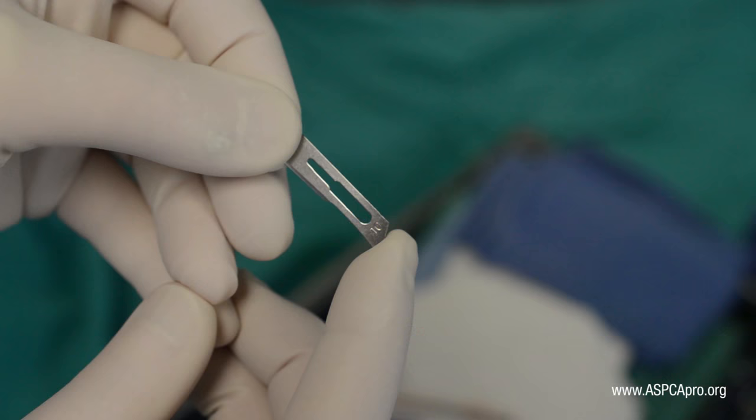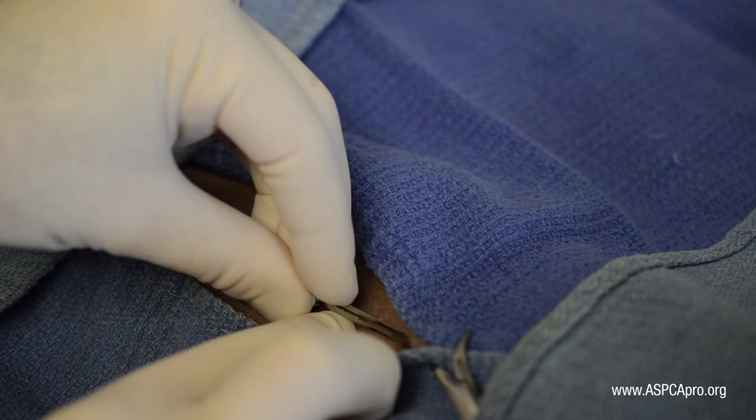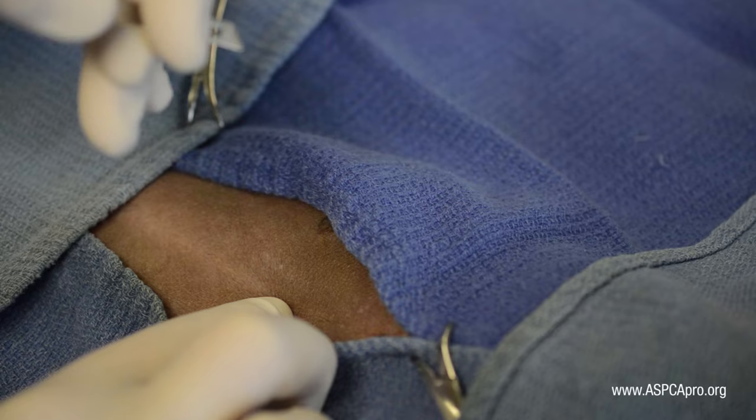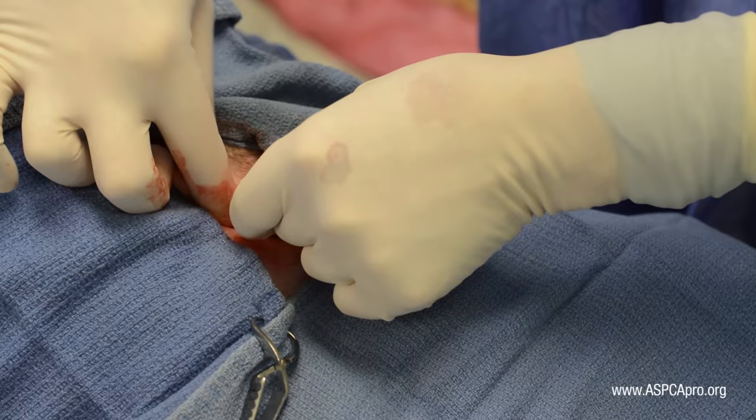A scalpel blade is measured from the blunt end of the scalpel to the end of the fenestration on the blade. For dogs less than 6 months old, the incision is started two scalpel blades caudal to the umbilicus, with the caveat that the incision is not started caudal to the midpoint between the cranial edge of the pubis and the umbilicus.